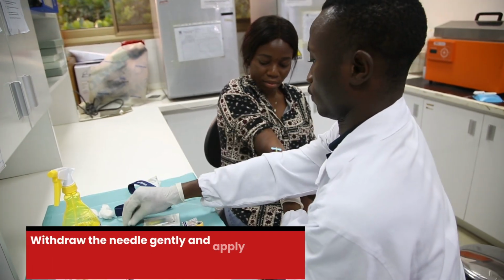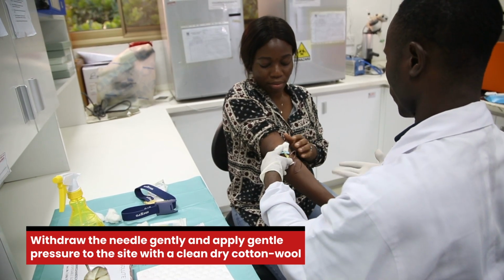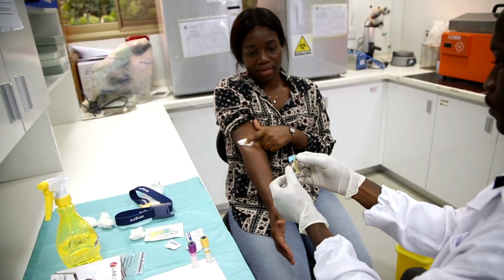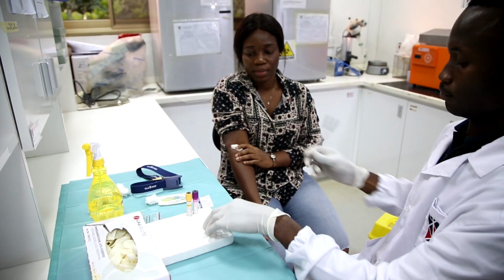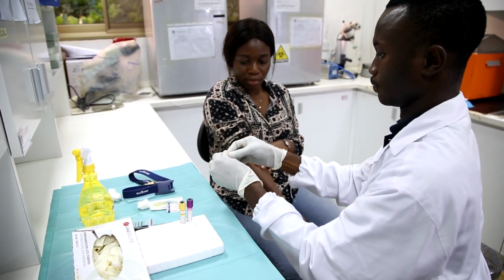Withdraw the needle gently and apply gentle pressure to the site with a clean, dry cotton wool. Ask the patient to hold the cotton wool in place with the arm extended and raised. Ask the patient not to bend the arm because doing so can cause hematoma.